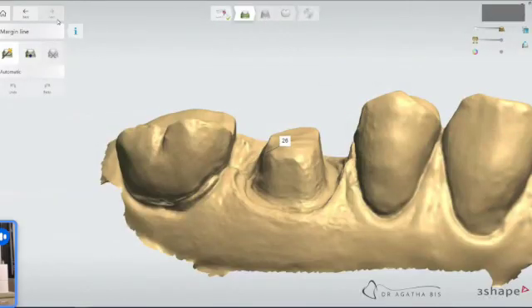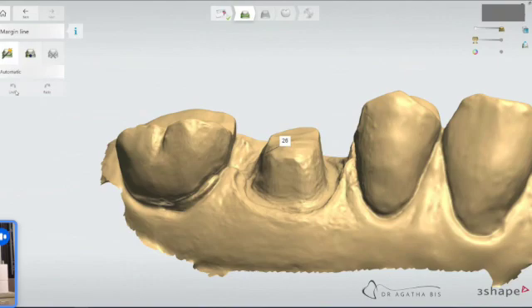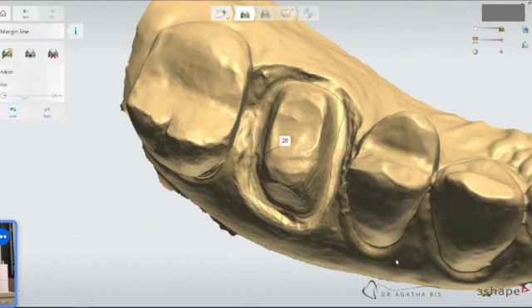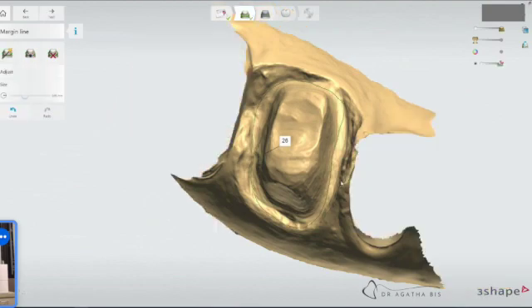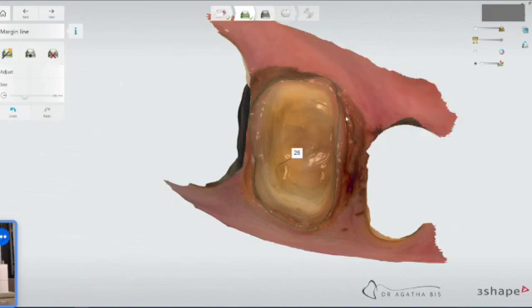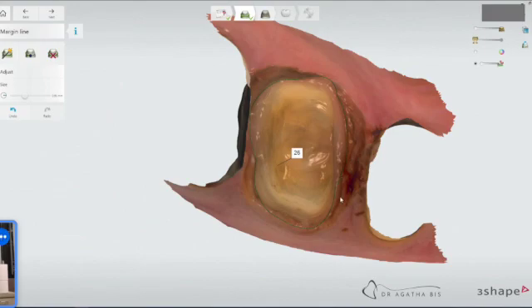You have the option of doing a margin line that's automatic or you can do a manual one. If you do the automatic, the system will just pick that margin line. Usually what I do is I switch it to clinical view to see the difference between tooth and tissue. I'll do a rough version outline.